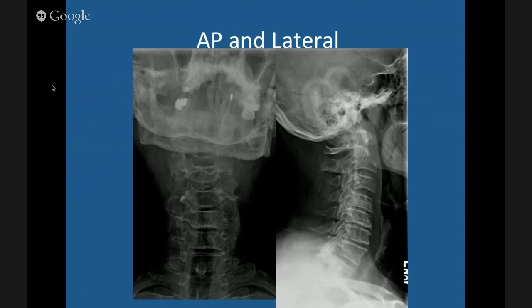On the AP film, the most important thing you can look for is the uncovertebral joints or the joints of Luschka. These are the joints of Luschka right here, and of course the disc. These are the spinous processes.